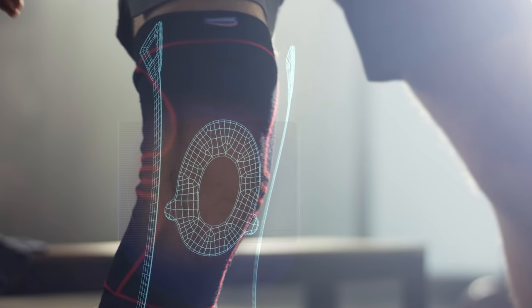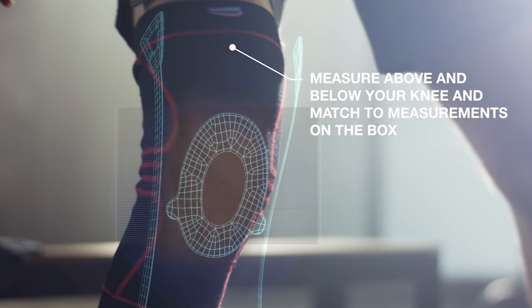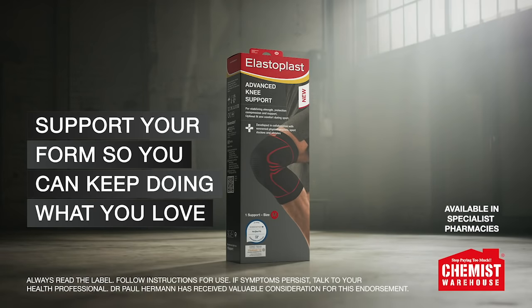Size and fit are important. Be sure to measure above and below your knee and match these to the measurements on the box. Support your form so you can keep doing what you love.